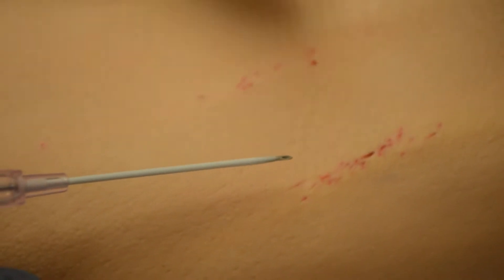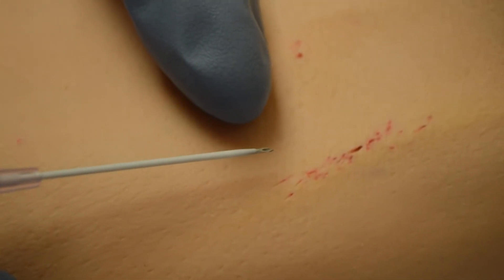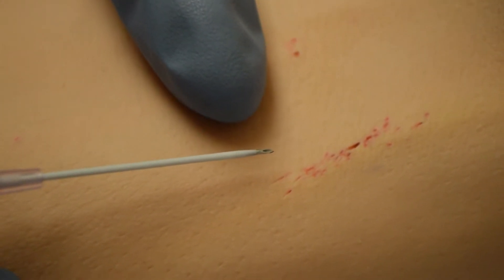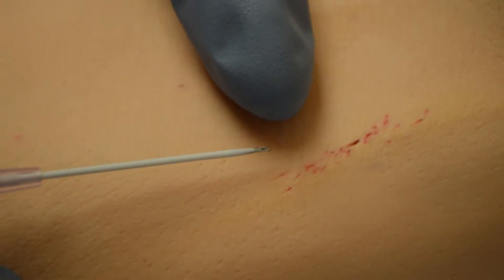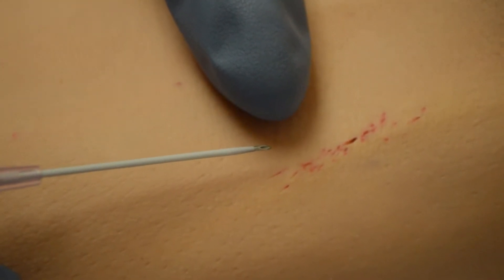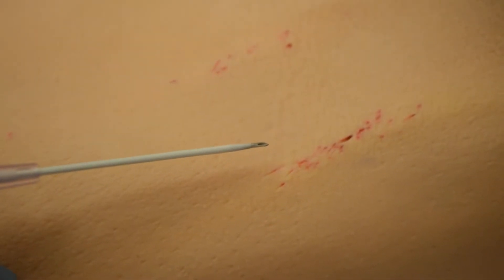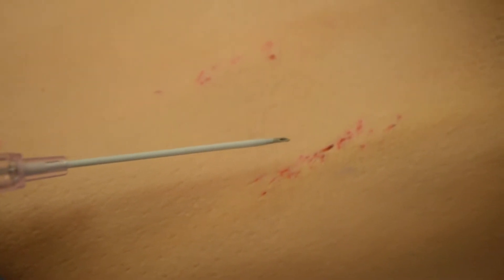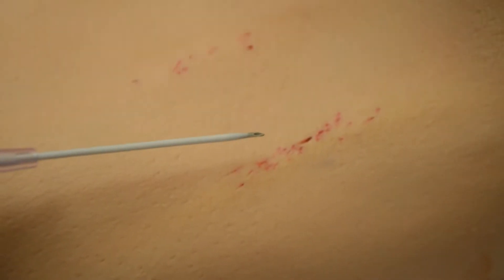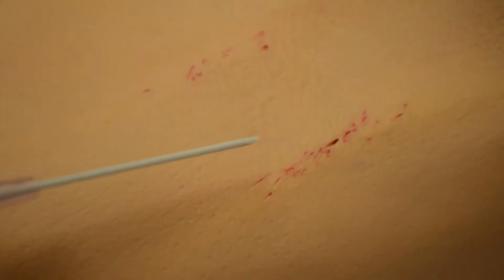This is the bevel of the catheter — this small sliced-out piece. This is the part that's going to give you the flash once you enter the vein. Seeing as how the catheter is set back from the end of the bevel, when you initially get a flash, that's just this small part at the end receiving blood into it. That is why when we poke our patients, once we get a flash, we flatten our IV needle out and then advance it forward a little bit so that it's seating back onto the catheter. That bevel is creating an opening in the vein for the catheter to slide over the end of the needle.